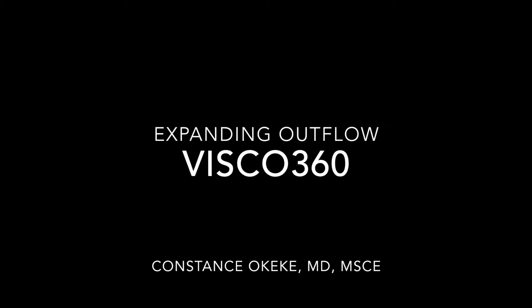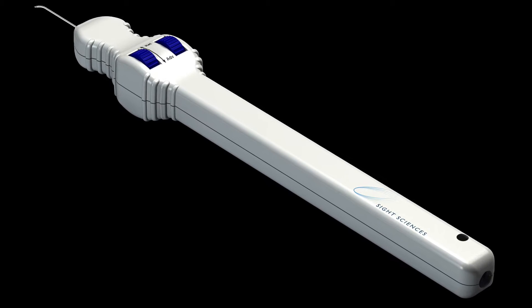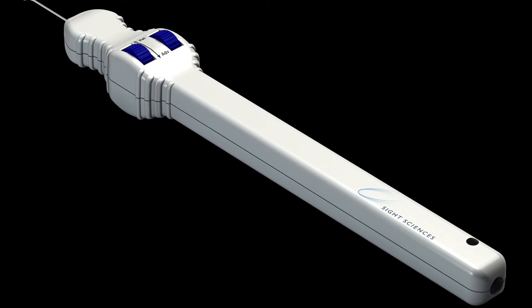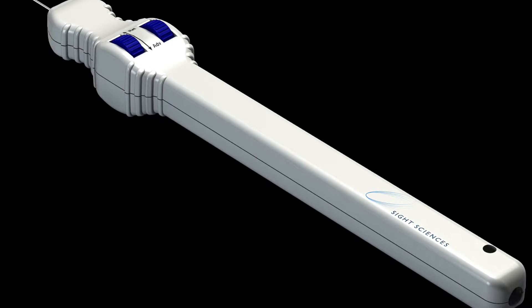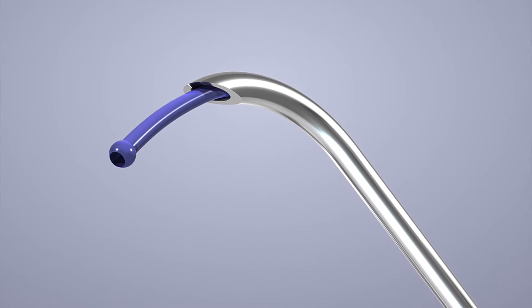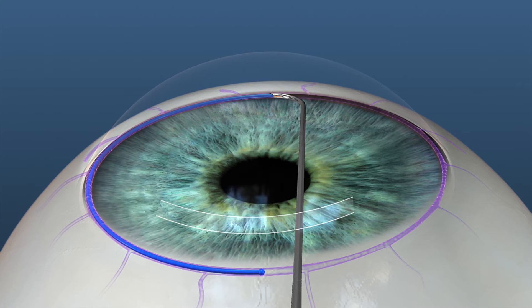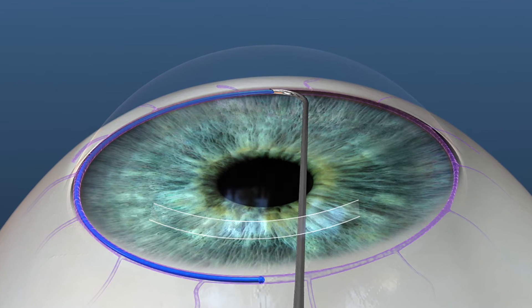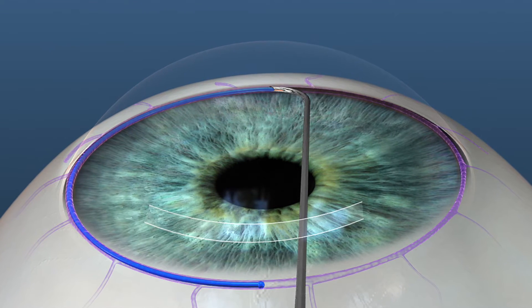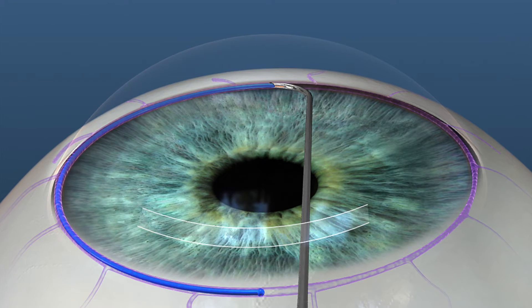One of the newest minimally invasive glaucoma procedures, Visco 360 by SightScience. It was released this year as a disposable, single-use instrument that has a featured control wheel that, when rotated, allows advancement of a flexible injection tube into Schlemm's canal for up to 360 degrees. When retracted, it delivers a small, controlled amount of viscoelastic fluid, which can separate compressed tissue planes where there could be adhesions, thus dilating the canal and the more distal collector channels. We'll go over initial insertion and gonio placement.